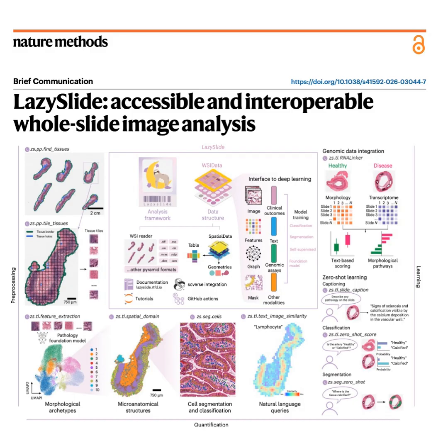A small university lab can now pull gigapixel images directly from a server without duplication, run them through state-of-the-art vision transformers, and statistically link that visual data to single-cell genomics. All using clean, concise Python code. Exactly. It speeds up biomarker discovery and paves the way for highly personalized medicine, and you don't need a Google-sized budget to do it. It fundamentally levels the playing field.